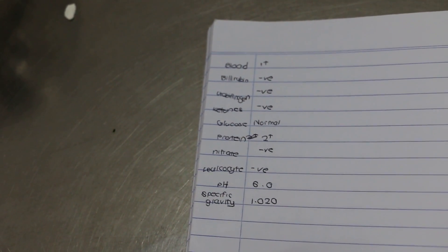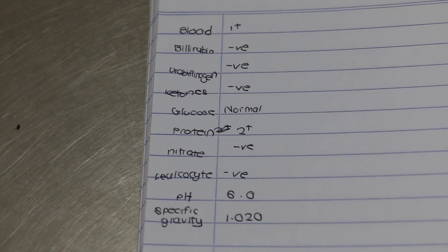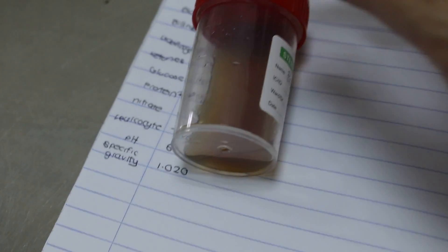The nitrite count is negative because the dog was treated by another vet three days ago on National Day — he was given a long-acting injection and penicillin or something. So it should be negative; that's why you must know the history. The pH is low, not high, because it has been treated with antibiotics. The specific gravity is 1.020. The only thing we didn't test is crystals — we will check under the microscope for urinary crystals. But this case is mainly prostate enlargement, as there are no stones seen on X-ray in the bladder, kidney, ureter, or urethra.